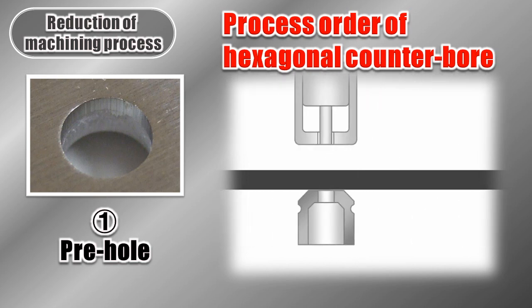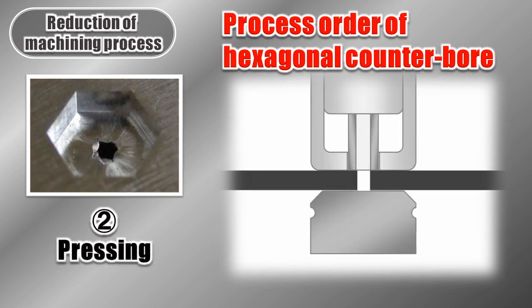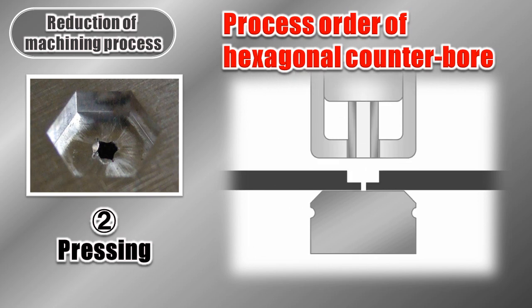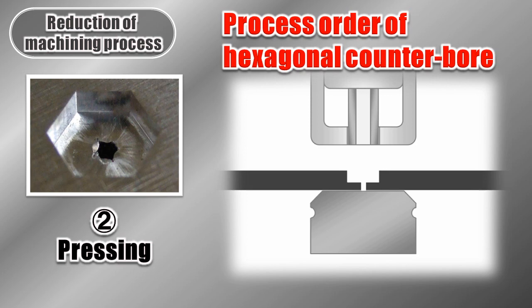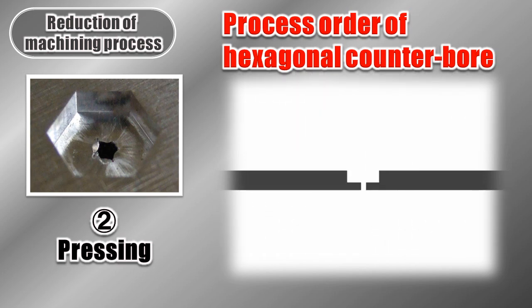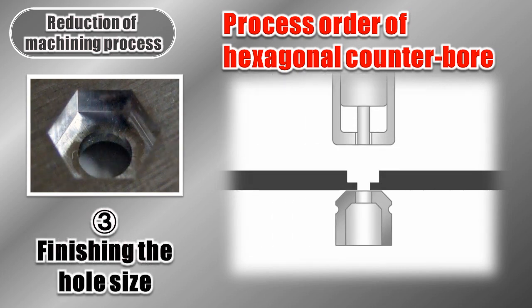The first step is making a pre-hole. The second step is pressing the sheet thickness with a special hexagon tool. The pre-hole made during the first step is made to prevent the material from deforming during this pressing process. The third step is fixing the hole size to complete the hexagon counter bore.